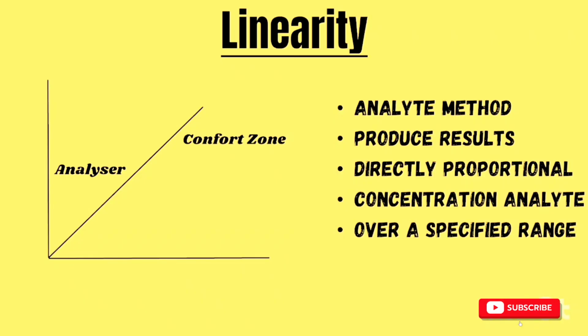That 0.9 is not the concentration of that bilirubin. That is not the amount of bilirubin that the patient has. What it is giving you is the absorbance. So linearity means that the analyzer would then have to carry that absorbance and check it against this 0.9 absorbance of bilirubin. Where does it fall under the concentration of the linearity of that straight line?